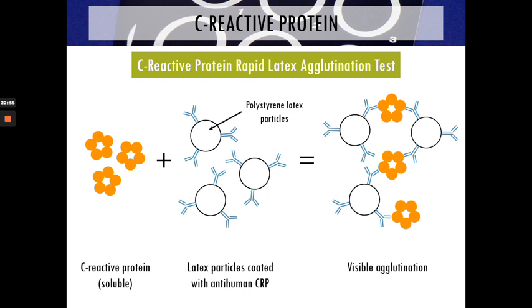Okay, all right. But if you want to quantitate the concentration of your CRP, I think you cannot do this using latex agglutination. It just shows you positive or negative, if you have CRP at that time or there is in a way inflammation that can lead to your CRP production. Okay. But if you want to do concentration, then we need mga automated higher sensitivity tests for that. Okay. Again, that's the limitation lang of this test.